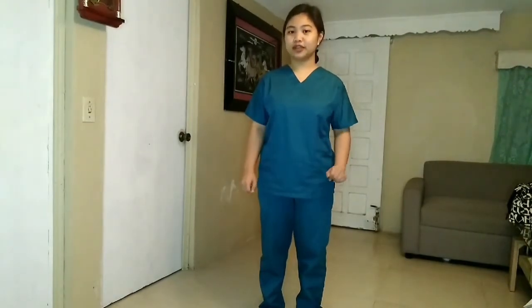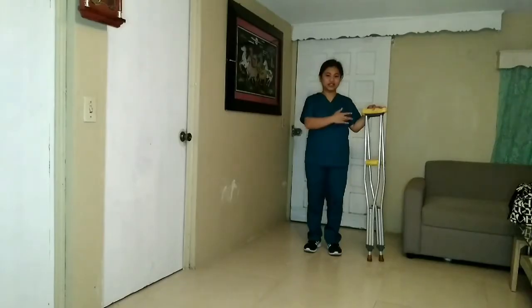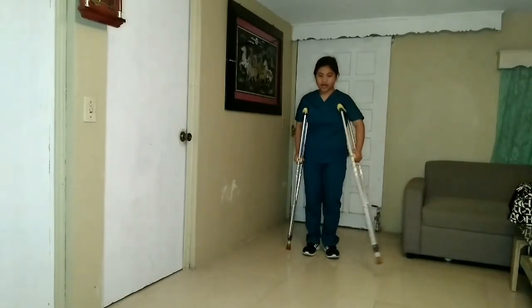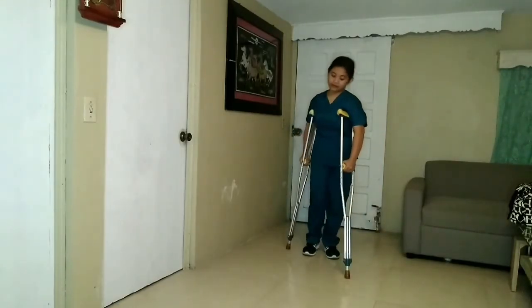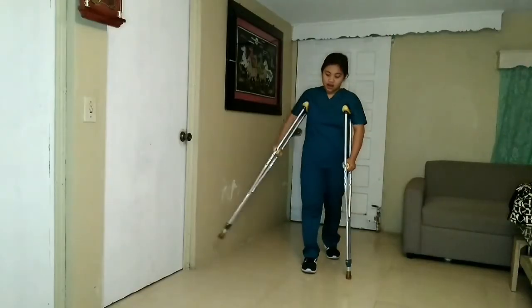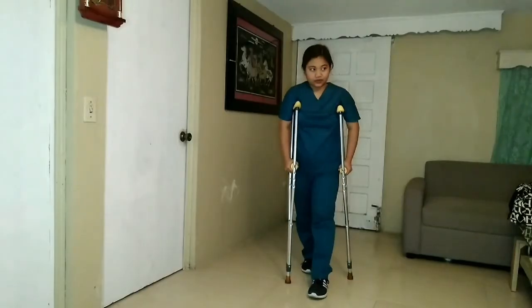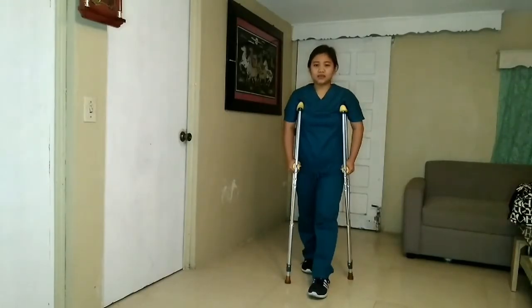Next are the crutches, and we will help our patient to walk by using the appropriate crutch gait. Instruct your patient to use the 4-point gait. By the use of these crutches, begin with tripod position. Place the crutch tips in front of the foot and make sure that your patient's weight is on the hand grips. Move the right crutch, followed by the left foot, then the left crutch, and then followed by the right foot. And then repeat the above sequence.